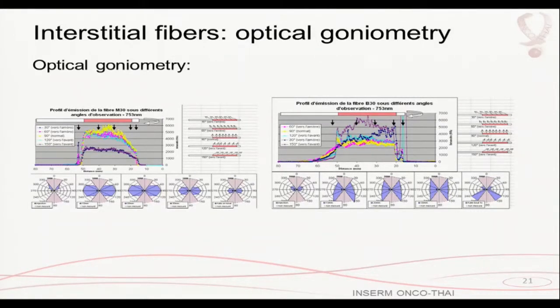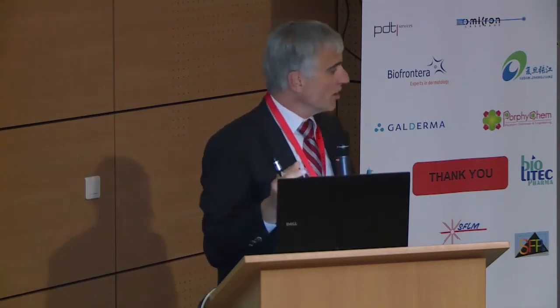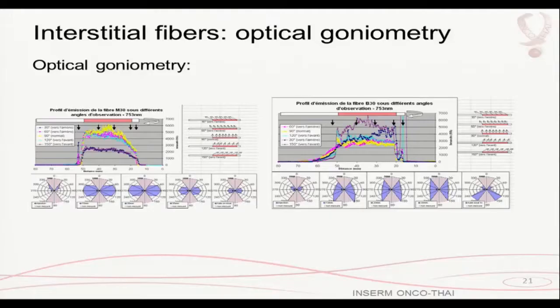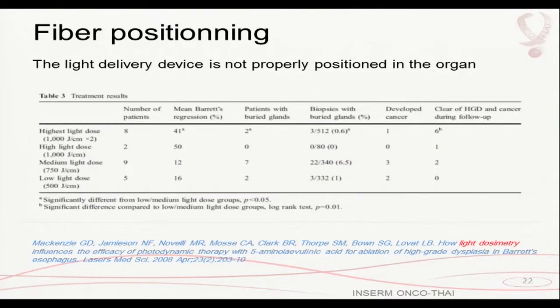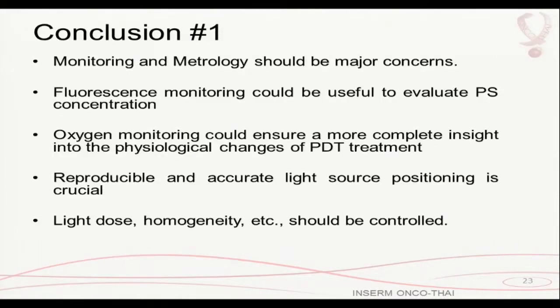You need a very sophisticated system. You need to know metrology, which is a science, to determine this and then apply it. Because the position of the fiber here was good, but in fact, I was not illuminating what I was supposed to illuminate. And about the fiber positioning, that's another thing. That's another paper by a group of Steve, where they demonstrated that the amount of light was really correlated to the light delivered to the tumor.